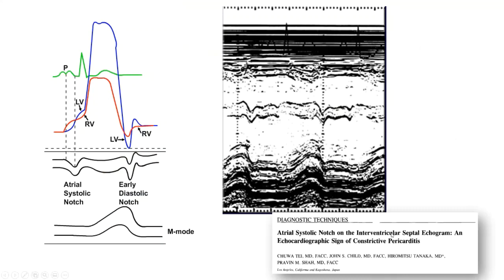This M-mode sign for constrictive pericarditis has been known since the 1980s. The early diastolic notch is thought to occur because the left ventricle — by reason of its geometry — is better able to generate diastolic suction than the right ventricle, creating a transeptal pressure gradient that favors leftward motion of the interventricular septum. The notch associated with the atrial kick has been described as follows: with constriction and atrial kick, the posterior wall cannot give, so the septum oscillates.